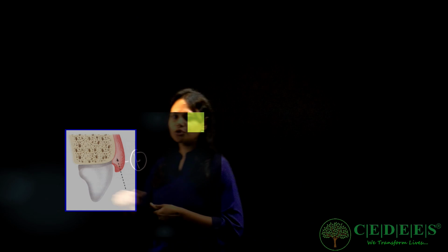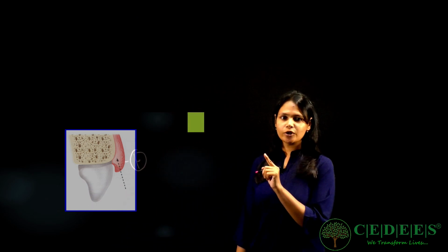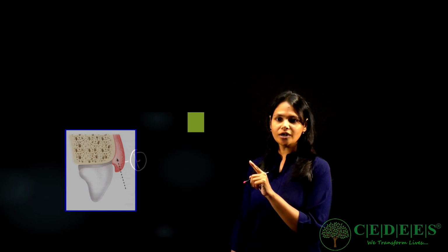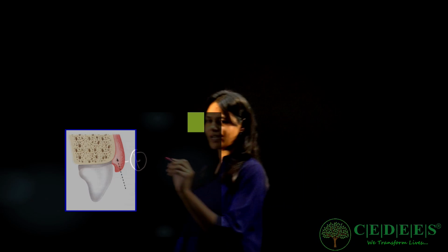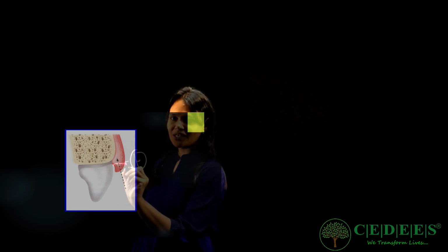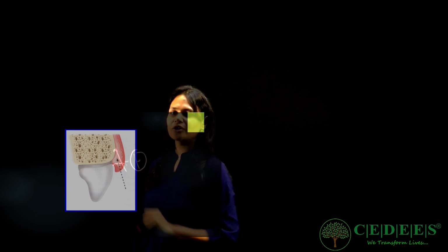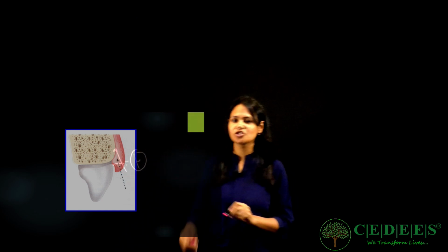So here I wanted to show you the different types of incisions. This one marked right here, 0.5 to 1 mm from the gingival margin is your internal bevel incision, that's right. If we take this pocket marking here and then we go like this, cutting a much larger part of gingiva, this is your internal bevel gingivectomy.